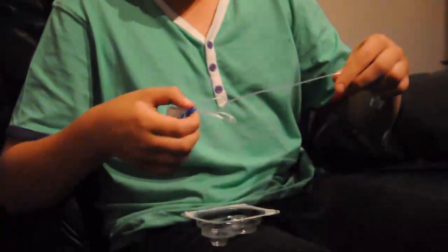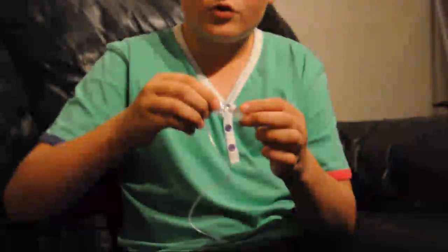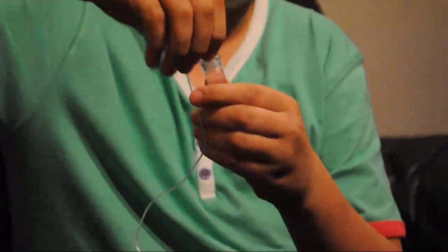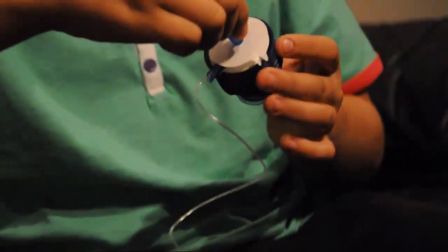And then at the end there's a little bit like that. You just put that on gently and then find when it fixes in, you push it on and turn. And same again, don't just push it straight on because you could break the top and it could damage the reservoir. Next you get your inserter and then you get the infusion set and then you just push that in.